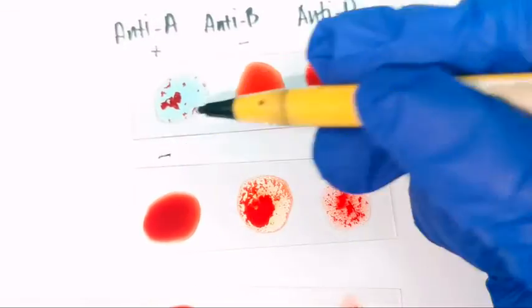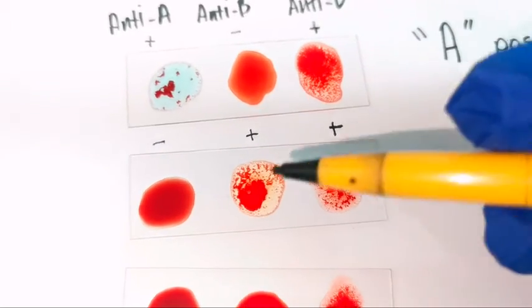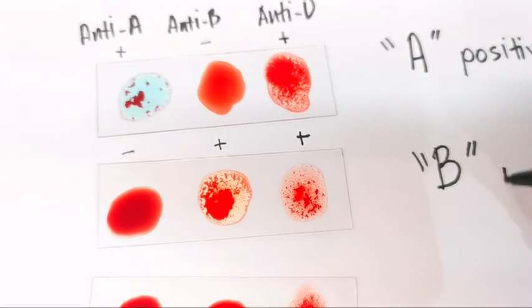In the second slide there is clumping on the drop of blood with anti-B and anti-D, and no agglutination in the blood with anti-A. Therefore the blood type is B positive.